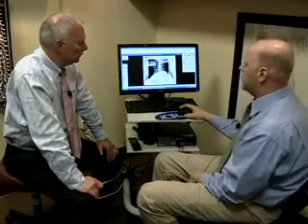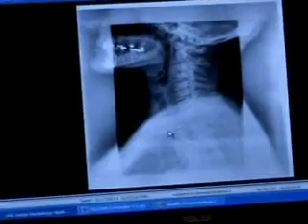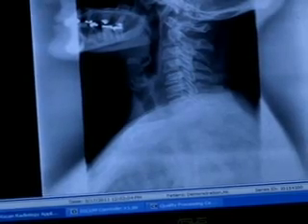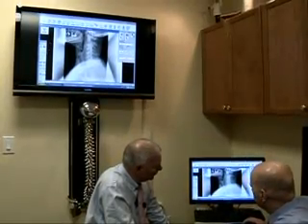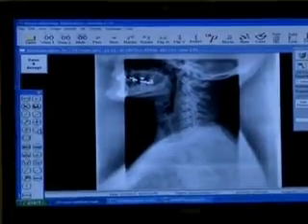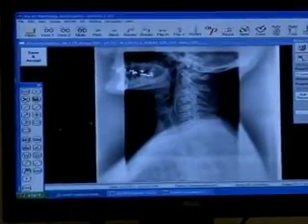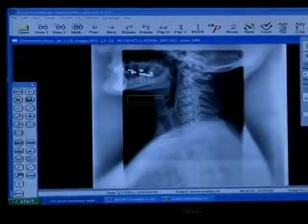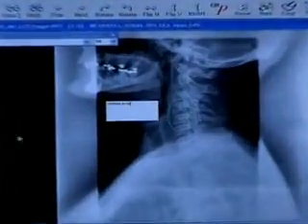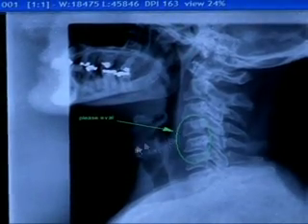So if we wanted to make certain annotations, we could say, let's get rid of this annotation. We'll delete that, and we'll say, I want to evaluate for this calcification here. I could put here what I'm looking for. So I would want to evaluate for this maybe density or calcification in here. So I could click on this area, circle it, and then write something in it in a dialog box here, like "please eval." And then I could take my arrow and say, there you go.